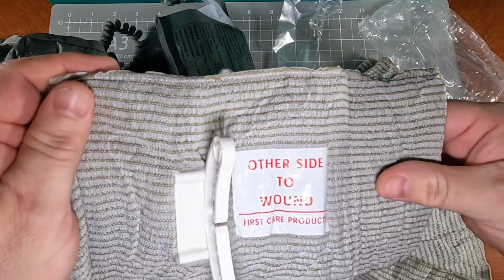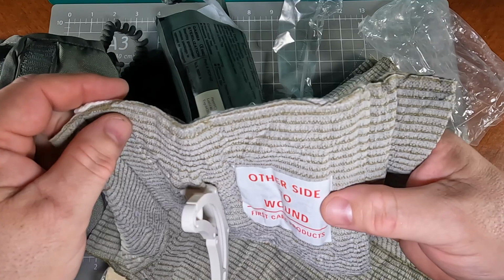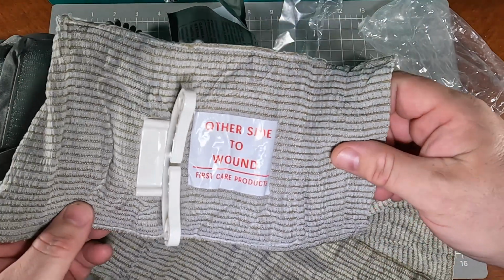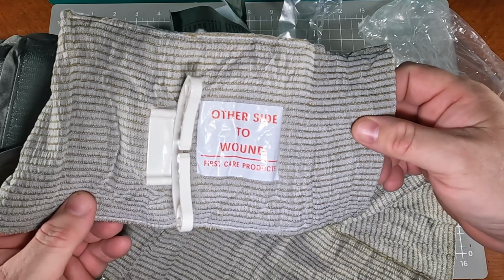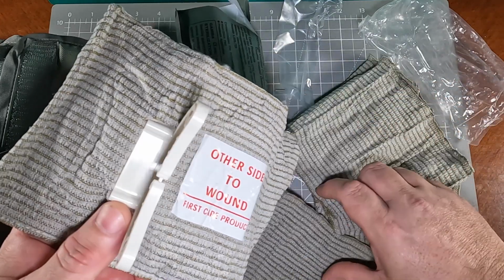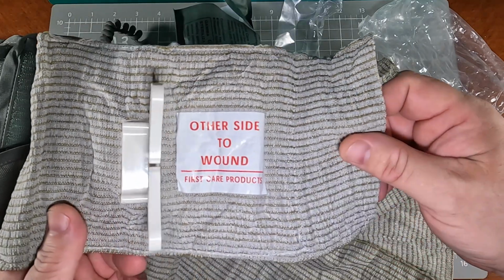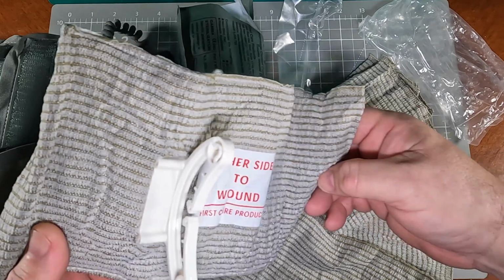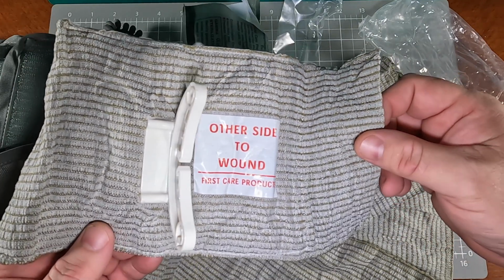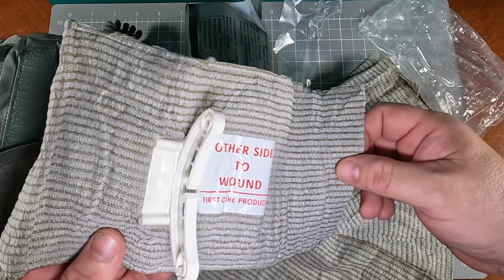In Vietnam, I think it was like 4 out of every 10 soldiers or more were dying in combat, and in Iraq, there's about 1 out of 10 that ended up dying from basically bleeding out. And what this allows you to do is treat individuals or even a group that's injured, and you can treat them in the middle of combat. A person can do self-aid to themselves, or once they get them to a safer place, they can apply it, versus back in the day, they'd try and strap a little bandage on them and then send them to the rear to get medical help.